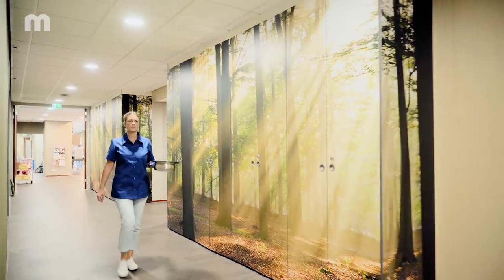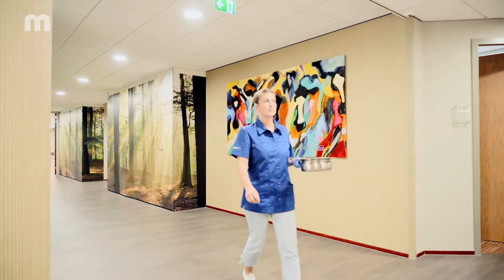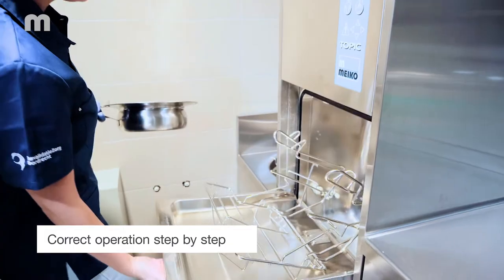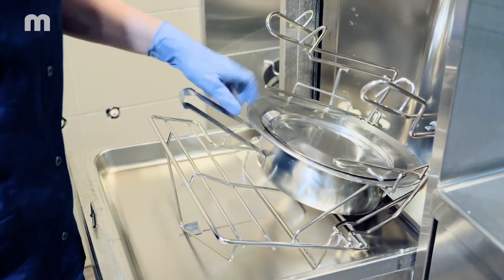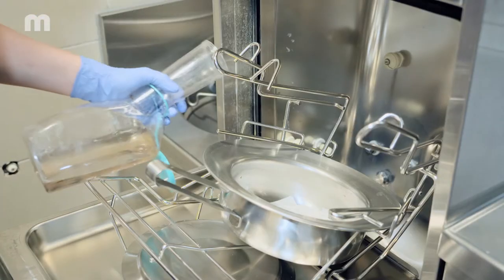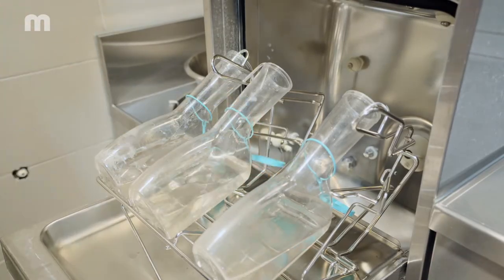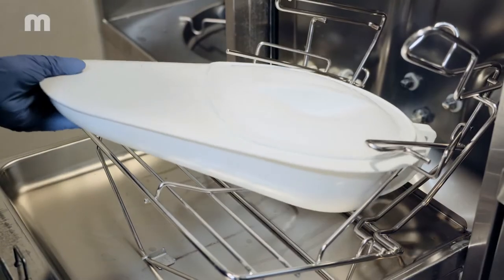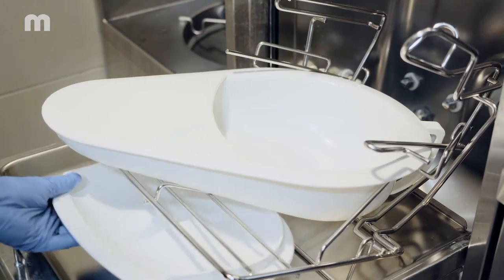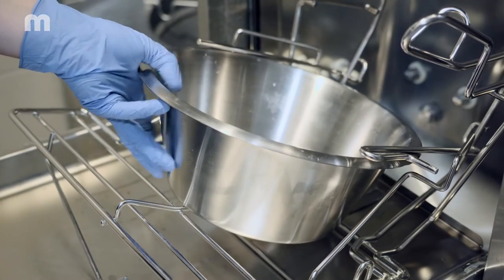Carry the filled care utensil into the dirty utility room with one hand while wearing a glove. Open the door to the room and bedpan washer disinfector with your other clean hand. Place the care utensil and contents into the bedpan washer disinfector. Take care to avoid contact with the contents and never empty the bedpan and urine bottle manually beforehand. It is very important to place the care utensils correctly in the holders inside the bedpan washer disinfector.